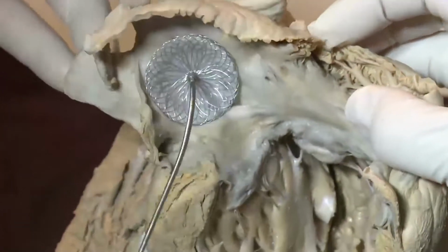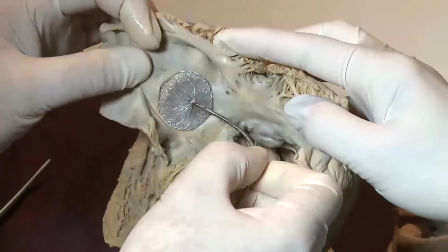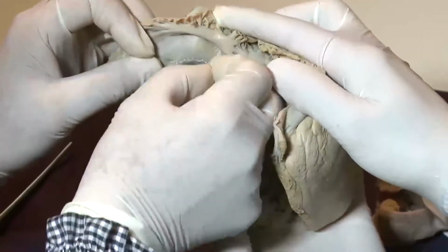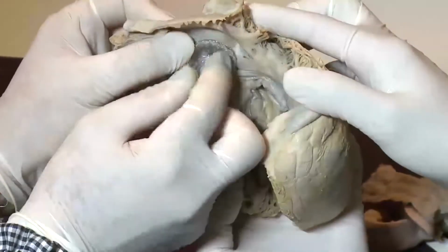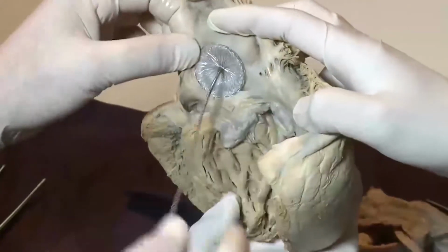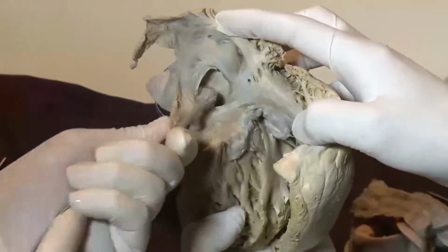Okay, do you think this device is too big or too small? It's a little bit small because it does not cover the anterior portion. Usually a bigger device, and usually the device plays over like this, aorta, posteriorly, the device like this. Okay, this is for ASD closure.